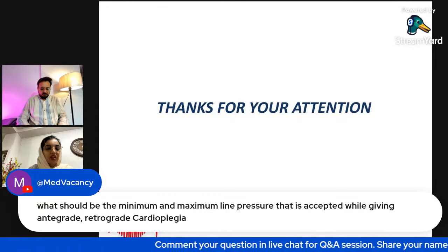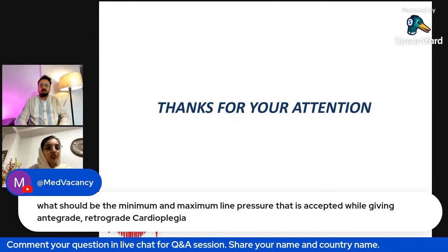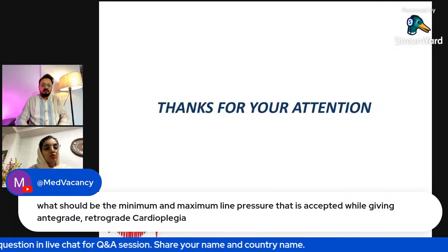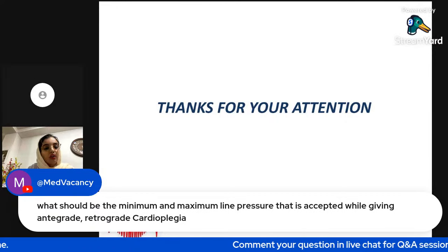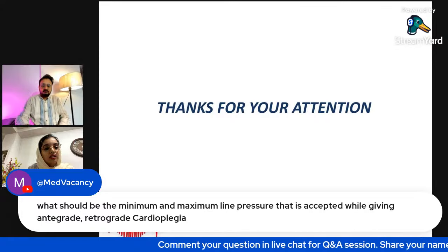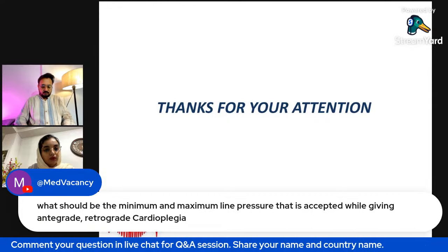The average is typically 70, but some references say 60 to 80 mmHg. For a child, it's better to inject by the antegrade method at lower pressure than in adults. The normal range of retrograde is 40 to 50 mmHg.